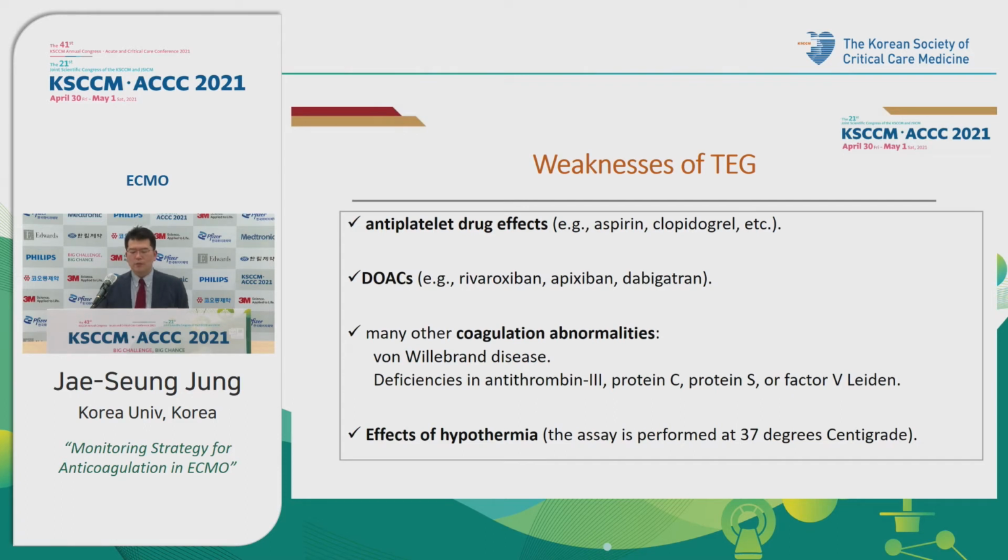Also, because the test is conducted at 37 degrees Celsius, it cannot detect clotting disability caused by hypothermia.